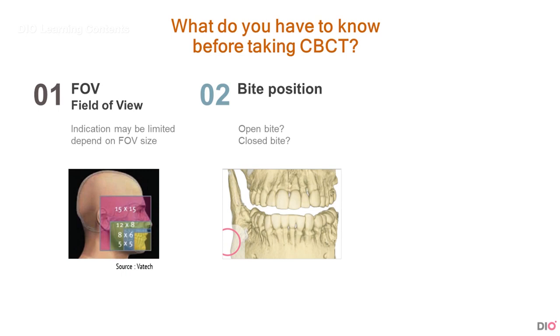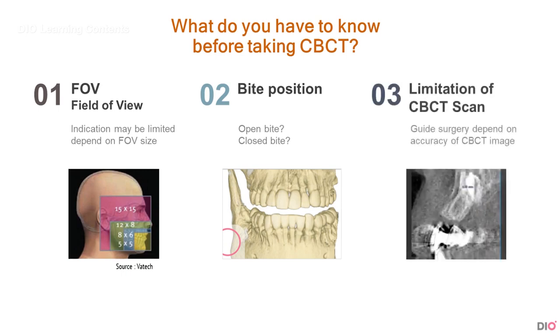The third is knowing the limitations of the CT. This is because the precision of the CBCT image determines the precision of the produced guide. We will discuss these 3 topics in more detail from the next page.